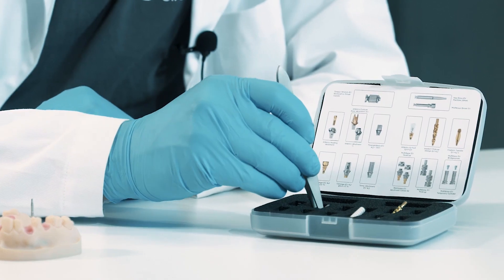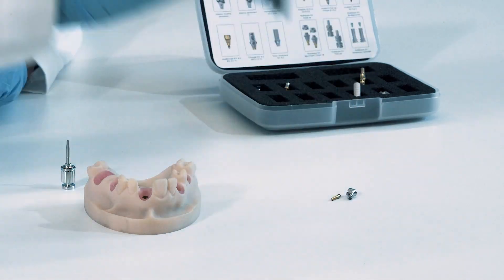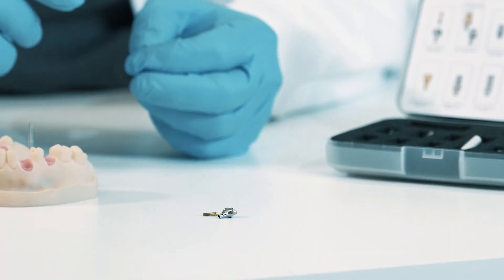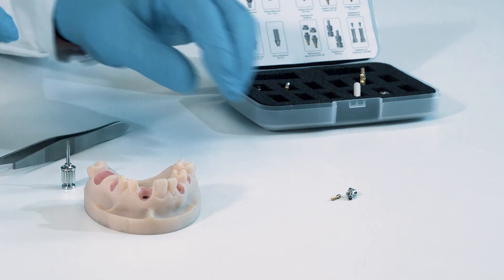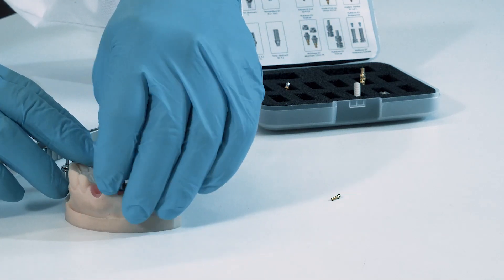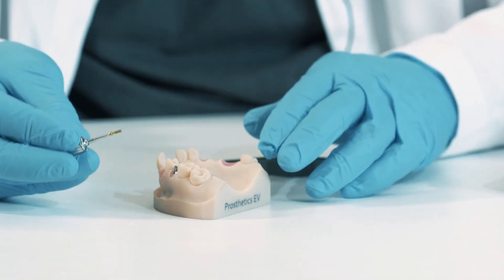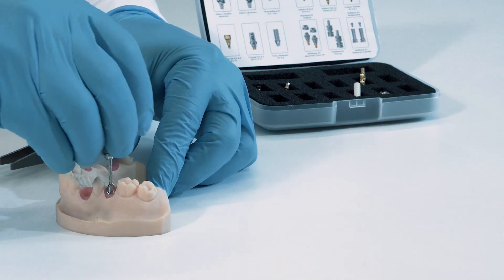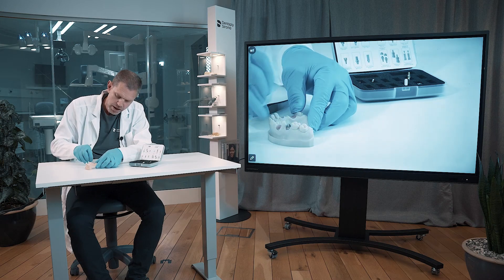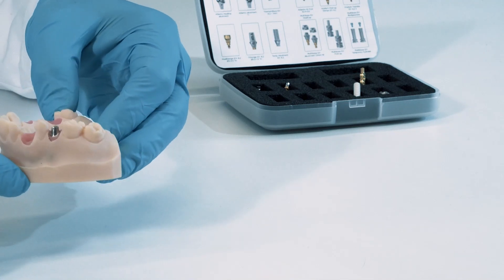The second abutment is in titanium only, without any gold shade. We've chosen this because it's going to sit a little bit further back in the mouth, in the posterior position. The same idea is to fit it into the only possible position with your fingers, and thereafter you come with a screw and the screwdriver. I want to emphasize the perfect match between the soft tissue and the margin on the abutment.